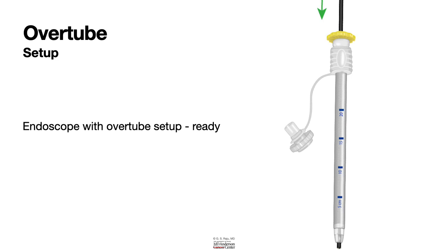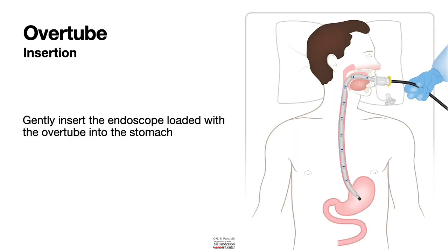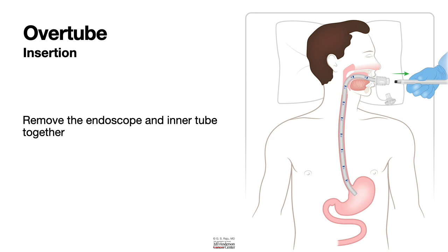It's also important to lubricate so that your insertion is easy. Make sure when you lubricate, you just lubricate the tip and not your hands. This device is too big to go through the bite block, hence it's important to remove the bite block before inserting this device. So you gently insert the endoscope loaded with the overtube into the stomach all the way, and then you remove the endoscope and the inner tube together.